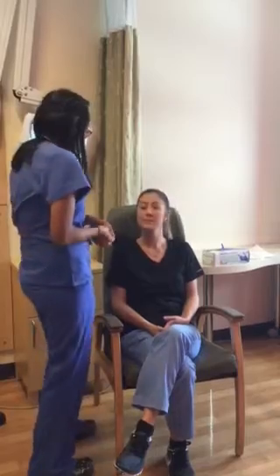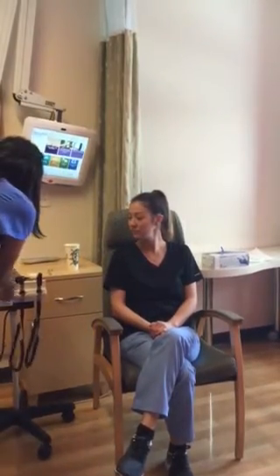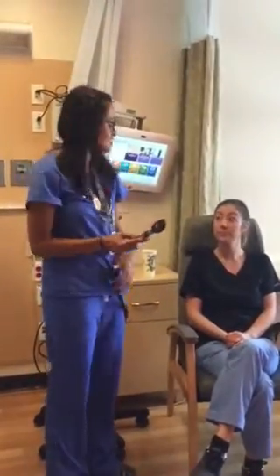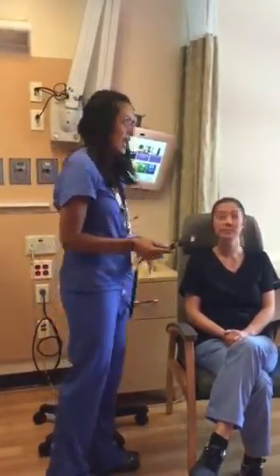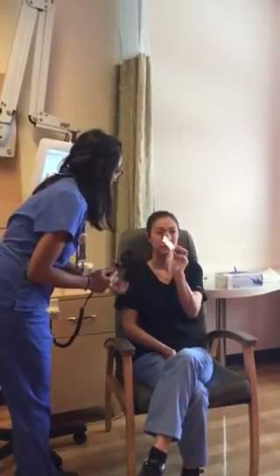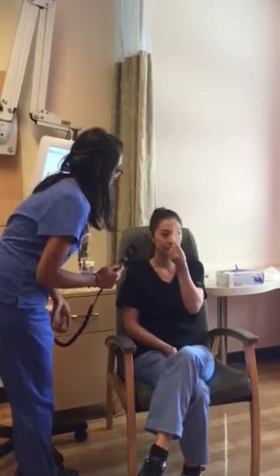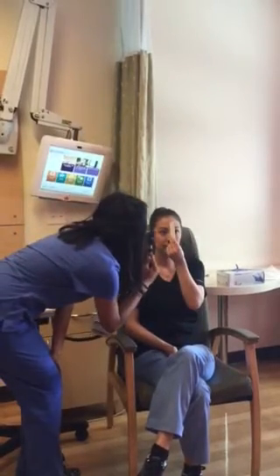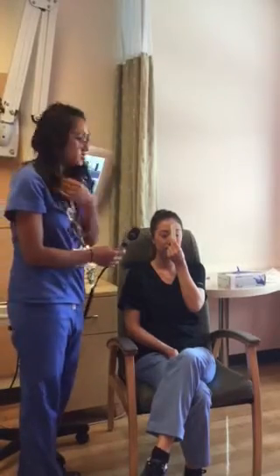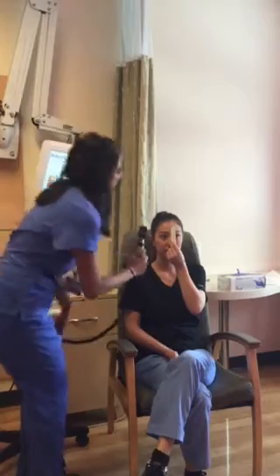So now I'm going to check Tiffany's eyes. I'm going to get my ophthalmoscope here. We're going to check that her pupils are equal and reactive to light and accommodation. So Tiffany, look straight ahead, and I'm going to just have you hold this card in between your eyes, please. Thank you. The pupil constricts, her right eye constricts. So now I'm going to do this again and see if the left eye constricts while I shine the light on the right eye.